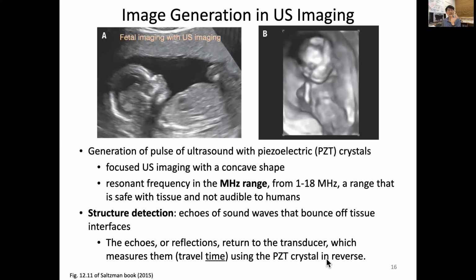If we split the time, then we can use the same piezo crystal for generating ultrasound and detecting the reflected ultrasound. And the B is when we have this 2D structure, if we move this 2D side by side and reconstruct, we can create even this 3D shape of ultrasound.